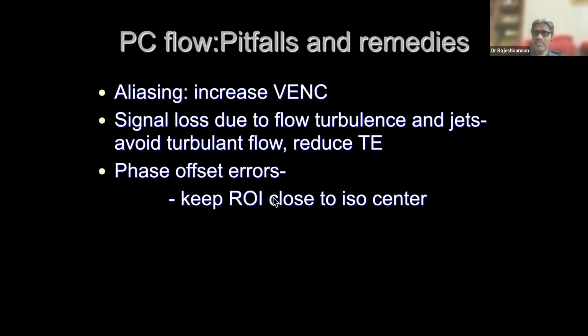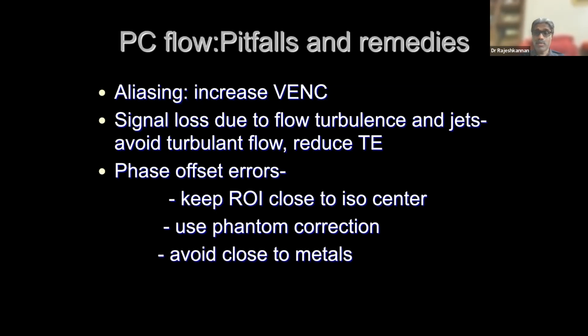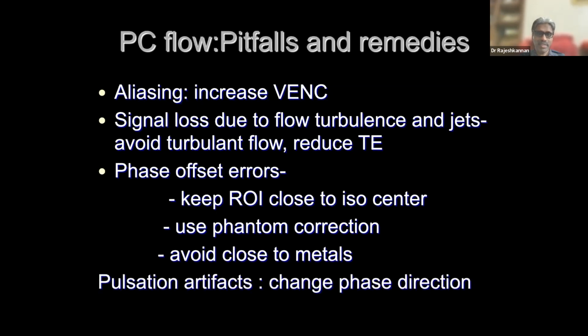See, if the baby is very small, instead of keeping it over the table, you can keep some sort of a pillow or something, so that you can raise it to the isocenter level. Also you can use phantom correction, even though it is very time consuming, but it may be useful in a few cases. And also we cannot do these PC flow studies very close to metals, because it will produce a lot of phase offset errors.